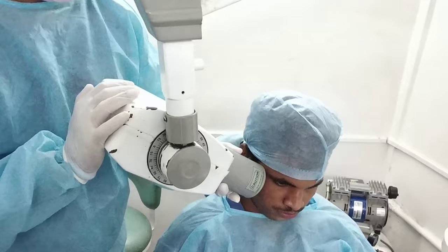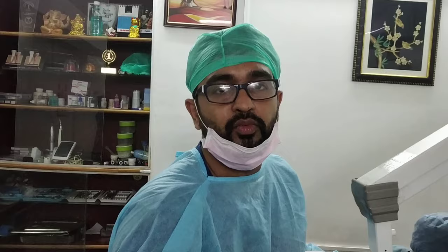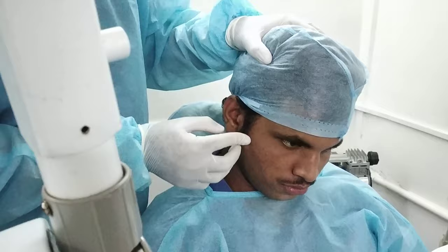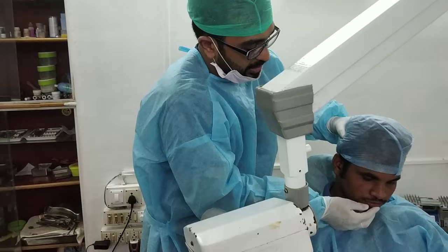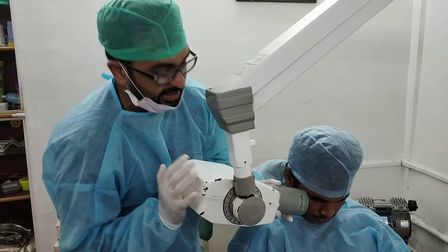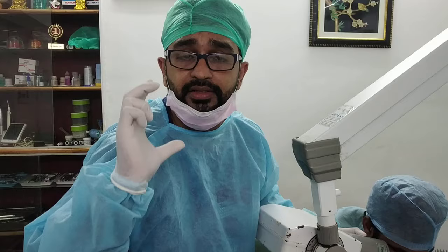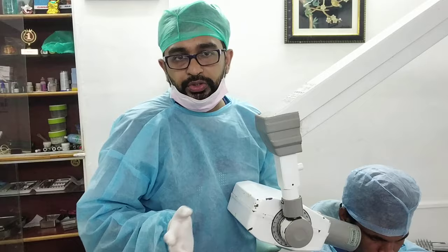Sometimes while taking the x-ray of the maxillary teeth — for example during root canal treatment of the maxillary molar — you cannot see the palatal canal because of the presence of the zygoma, the malar prominence, the U-shape bony structure in some patients. If you cannot see the palatal root, you need to take two to three different angulations. For example, you need to straighten the head a little and tell the patient to tilt the head totally downwards, then take the x-ray focused on the palatal root. You have to visualize in your mind where your x-ray film is and where your cone is, and try to make the tooth-film plane parallel.